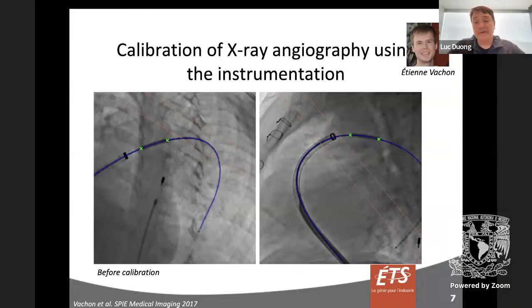We could use the catheter size to calibrate, to do like a calibration object, and to use that catheter for self-calibration. So to calibrate the imaging systems, to calibrate using the catheter inside the patient. This is appealing for 2 reasons. First, the catheter is already inside the patient, and 2, it's because it's really a local calibration. The calibration using a calibration object like this one, it calibrates volume around the patient. But if we use the calibration that is really local to the patient, we think that we have a better calibration.